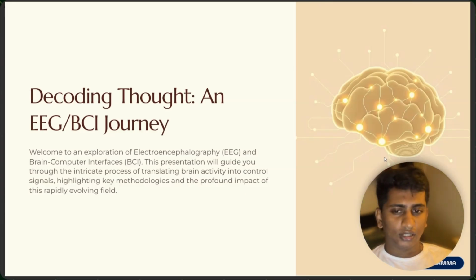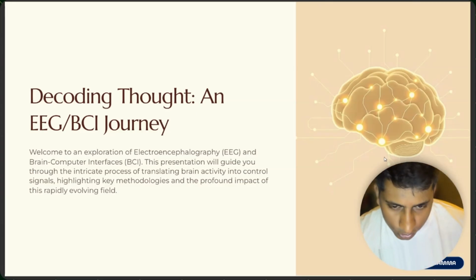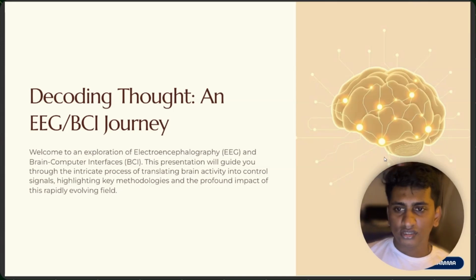Today I'll be presenting a conceptual overview using slides. Then we'll go to some mathematical details using a LaTeX file, and finally I'll show you a live demo in MATLAB with EEG. Okay. So first, we'll have a decoding thought on the EEG and BCI journey.